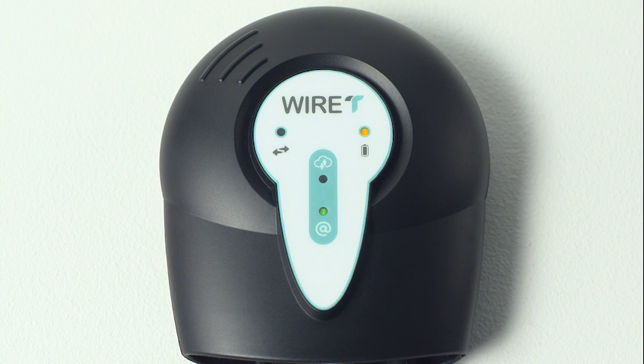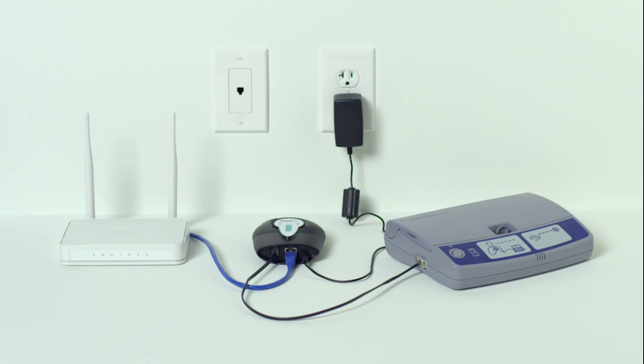A flashing green light above the network symbol indicates that the internet accessory is connecting to your home internet router. A solid green light confirms that the internet accessory is properly connected to the router and ready to work with your CareLink monitor. With the unit powered, you're now ready to test the new components.